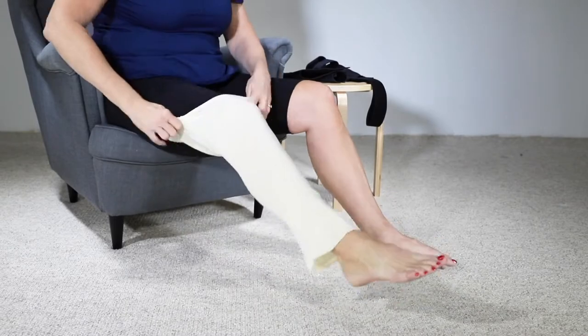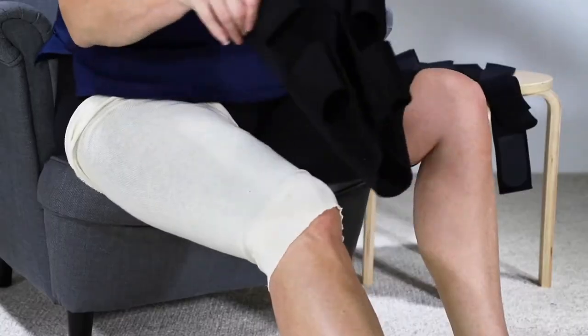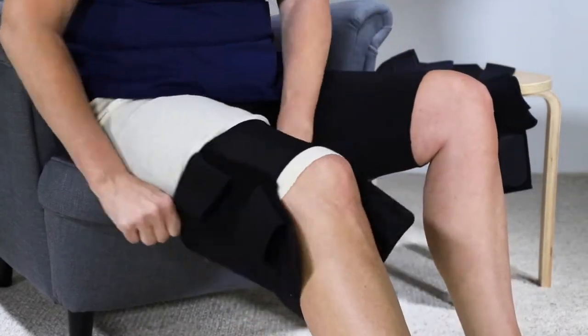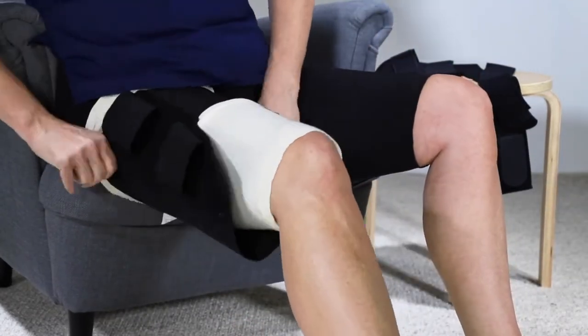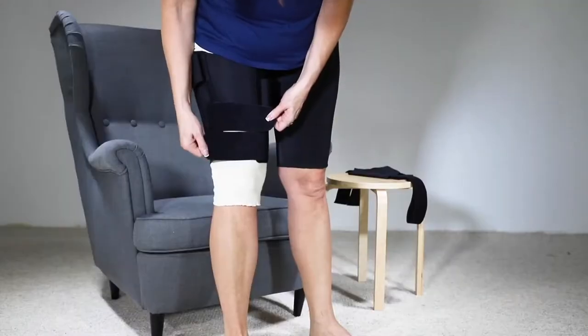Make sure your skin is clean and dry and apply one of the provided liners. With the stretch panel facing forward, slide your leg into the wrap. Pull it up the leg until the garment is seated just below the gluteal fold. The bottom of the garment should be resting right above your knee.